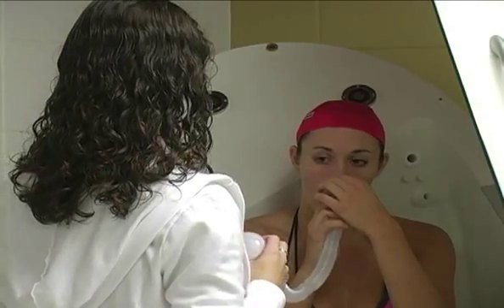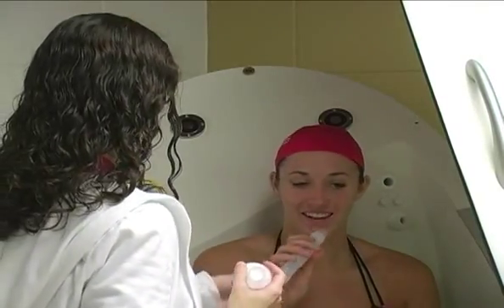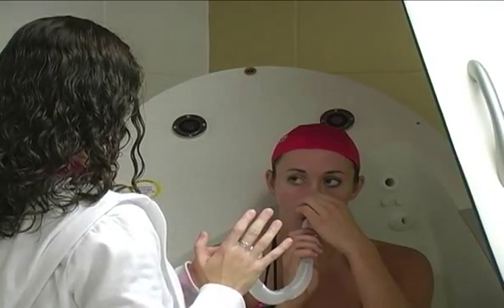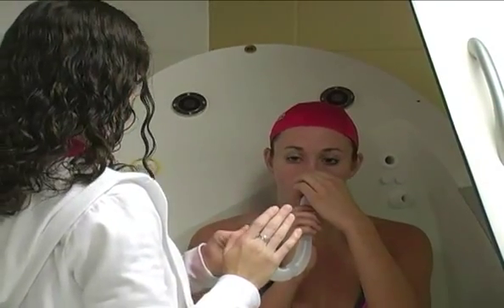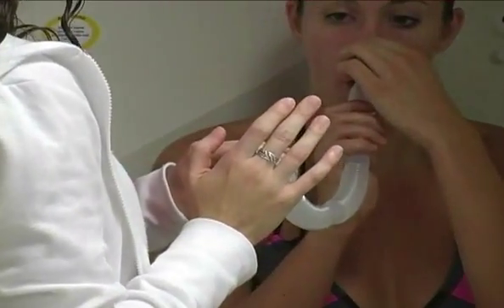So let's just start from the beginning. So you're going to go. Perfect. So let's try it with the tube. Plug your nose. And you're going to feel a little bit more resistance when you're doing this, so don't get worried. And you want her to huff as soon as you plug it. You didn't plug that, did you? So just, there you go.